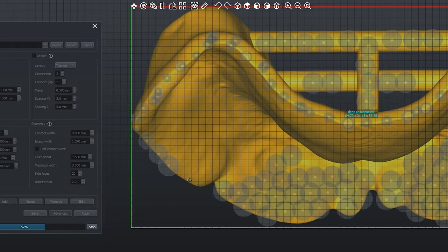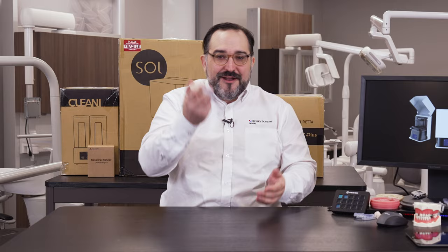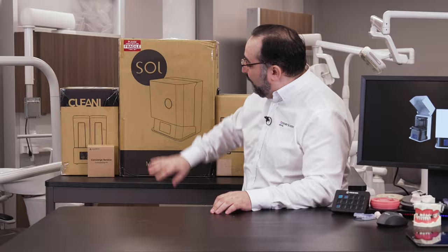3D printing is one of the most exciting new dental technologies of the last five years. Whether you're printing night guards, digital dentures, or models, we're trying to figure out how we should be doing these things. That's why you're lucky to be here with us today because we're unboxing this beautiful Acureta Sol to show you how easy dental 3D printing can be.